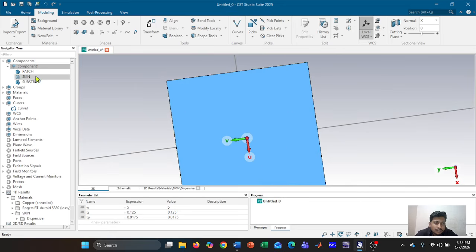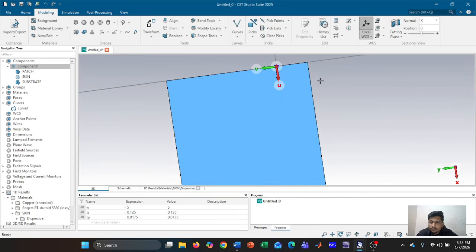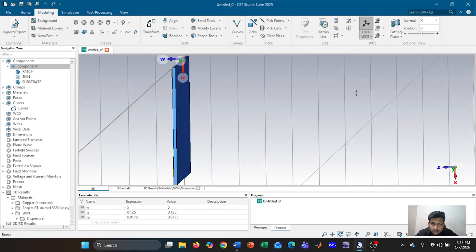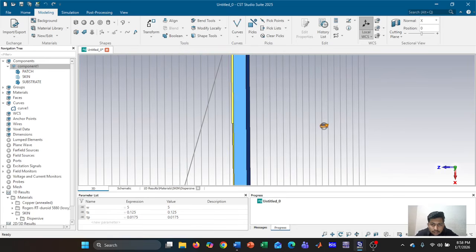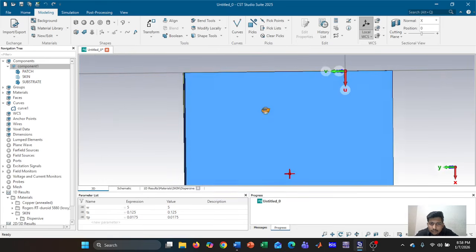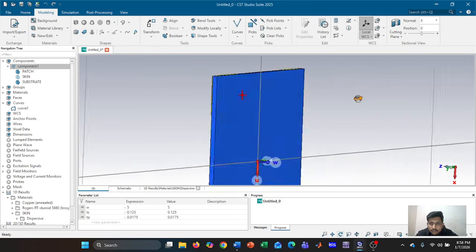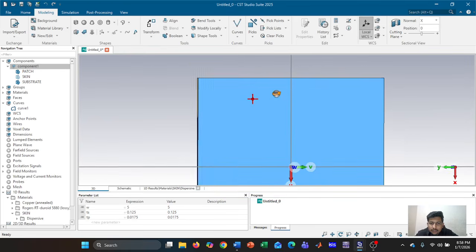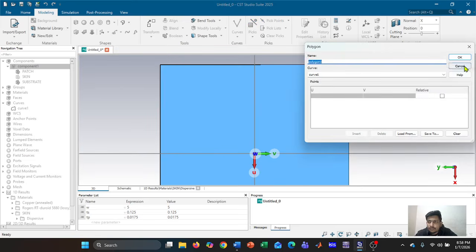Okay, so as I am going to design the back side, first of all I need to select the back surface. Okay, not selected. Okay, now I have selected the backside surface. Now I'm going to design the patch. Wait a minute, it will be easy.